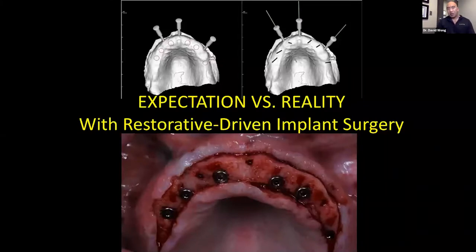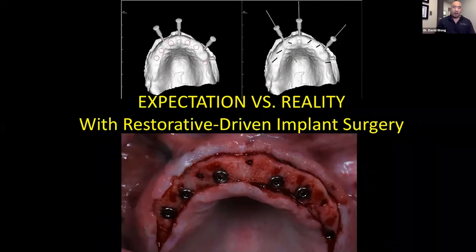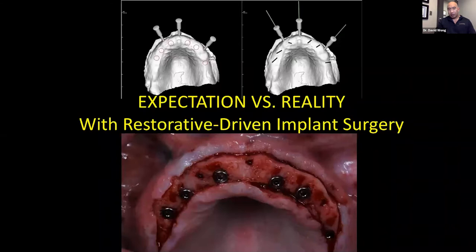I always joke that expectation and reality are two different things when it comes to full arch. You can see where Dr. Massad planned the implants on top, and then on the bottom you can see where the actual implants went in with the surgical guide — way different, completely different, but it's where he wanted them.